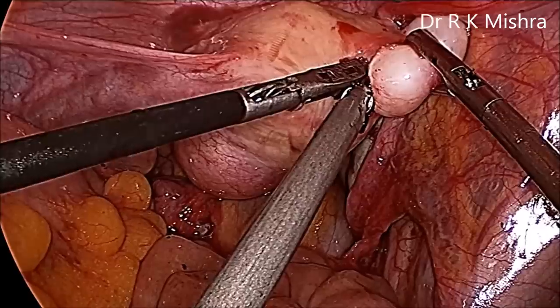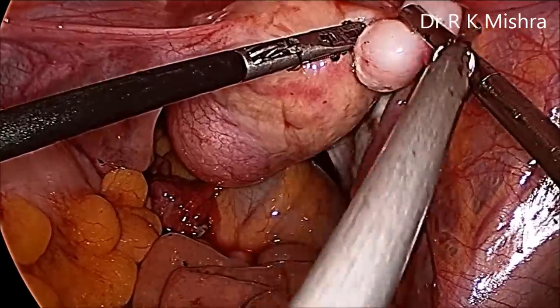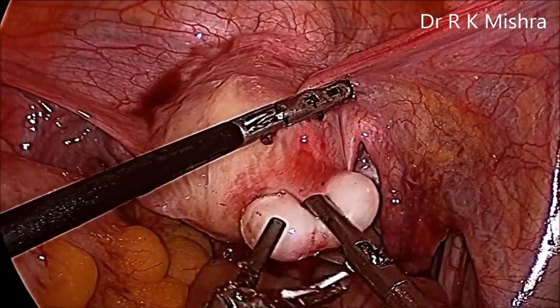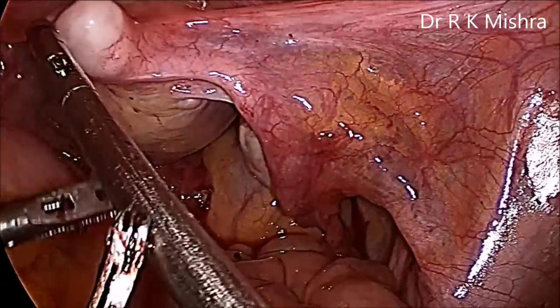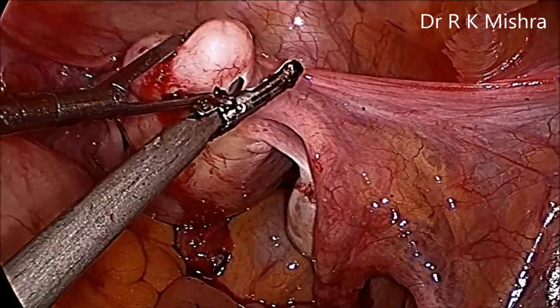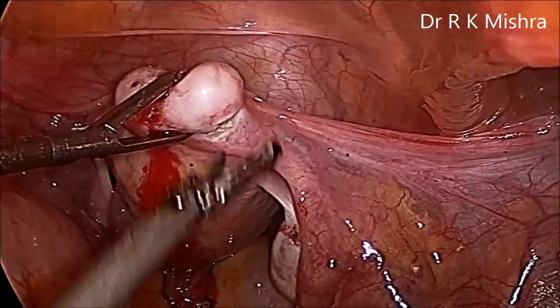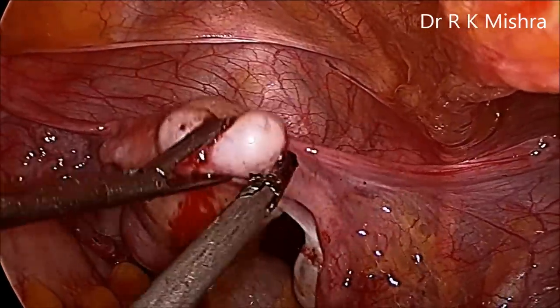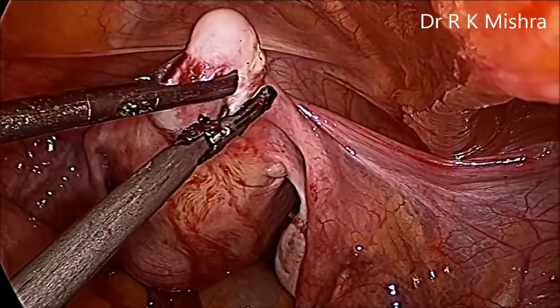The harmonic is dissecting, keeping the level of dissection much towards the fibroid rather than the uterus, because the lateral end of this fibroid is just over the cornual end of the tube, and that was giving pressure over the tube so the tube on that side was blocked. We have to preserve the tube and remove the fibroid, so the dissection is done at the serous layer to keep it away from the tube. Although the serosa of the tube may get slightly injured, the mucosal layer will not be injured.